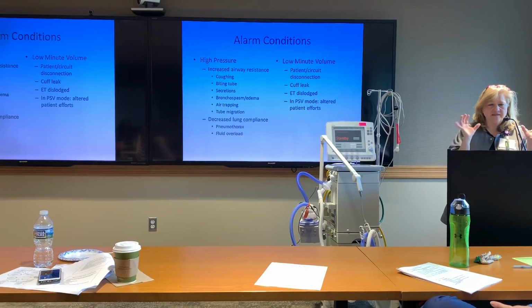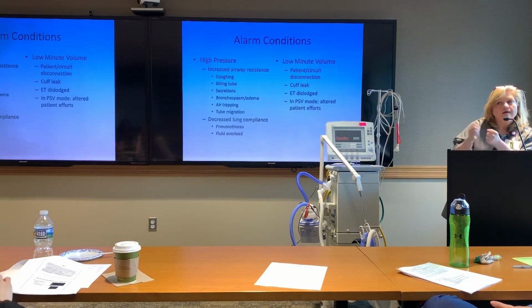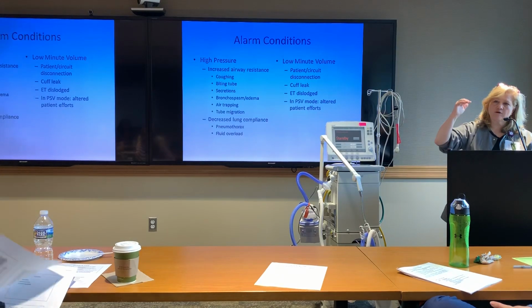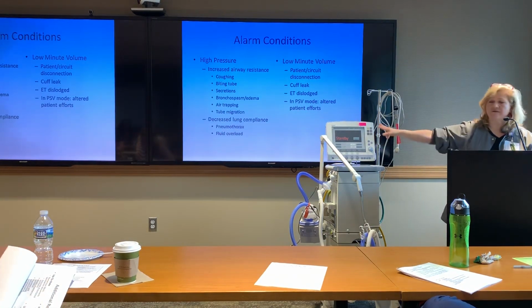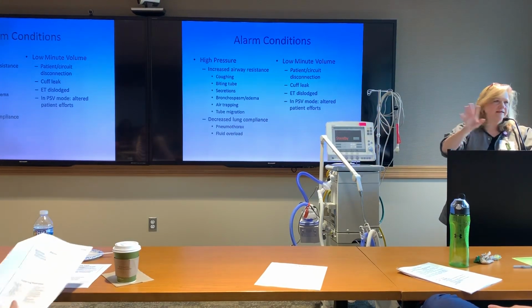That's one of the benefits. It's the safest mode of ventilation. It's not perfect for everybody, but it's the best of both worlds, consistent tidal volume delivery and safe pressures, so we like that. But if the patient's lung condition changes and it's taking more and more pressure to achieve that tidal volume goal, it's going to eventually stop, and it stops at 5 centimeters below where I have my high pressure limit set.